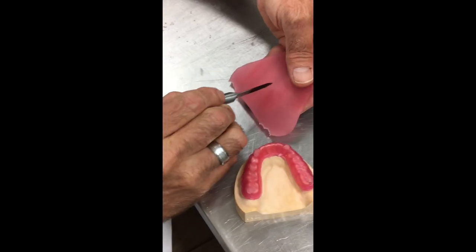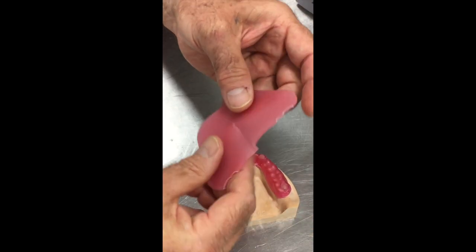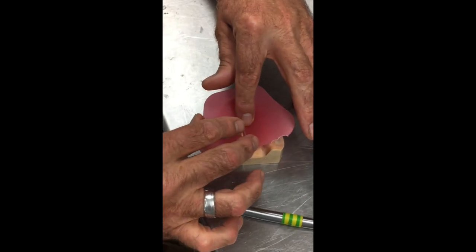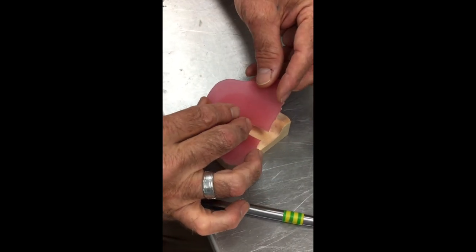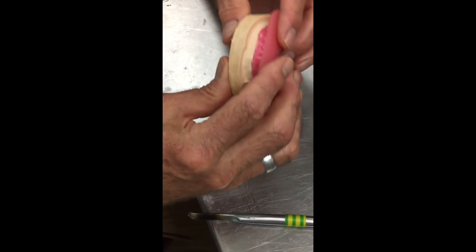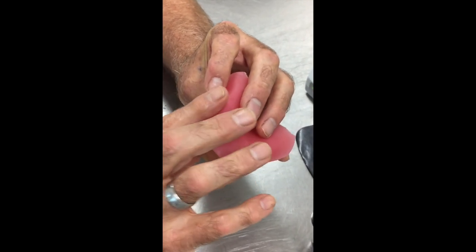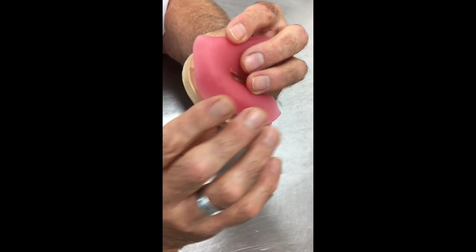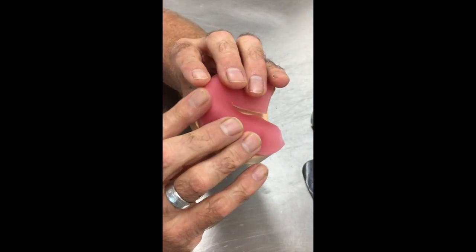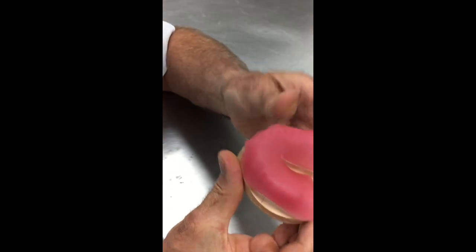Now, once again, I'm going to place this little cut in here so that this material doesn't stretch, because we want it to remain thick and strong if we possibly can. So now we're going to just let this, under its own weight, more or less, droop onto our tray surface, and we're going to position it so that the periphery comes down to that margin all the way around. Now, we don't want it to fold, so if we gently massage it like this, it's going to come down to the periphery, and we're not going to push a thin spot in the tray material everywhere.